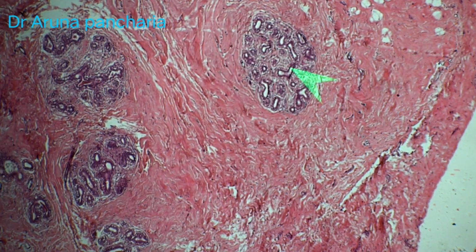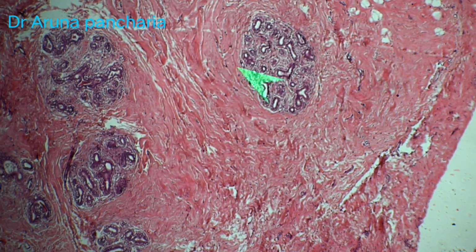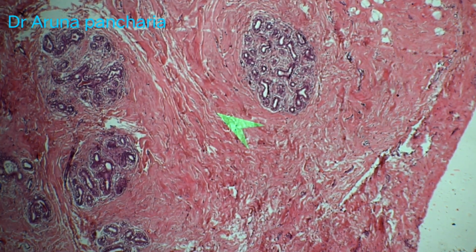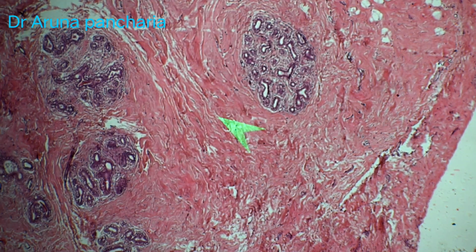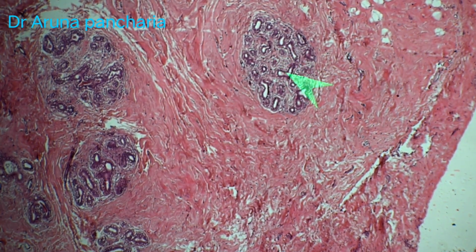All these are the lobules, one lobule, this is another lobule, and under low power also you can very well appreciate the intralobular stroma as well as the interlobular stroma, because interlobular stroma is less cellular and dense, while intralobular stroma is cellular with some myxomatous change, a bluish hue you can see, and it is more cellular.